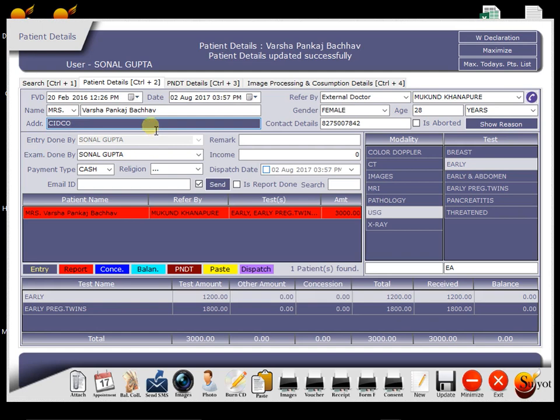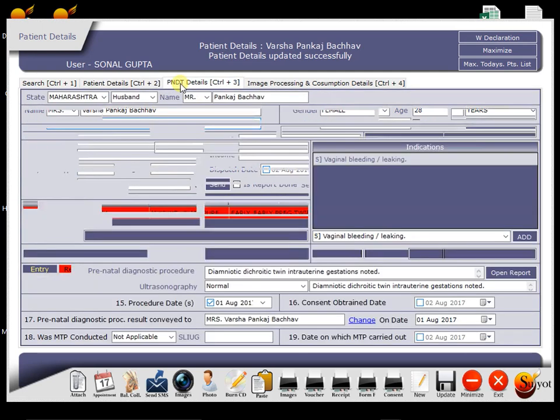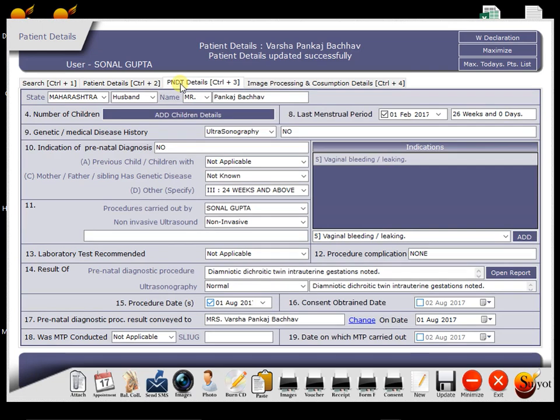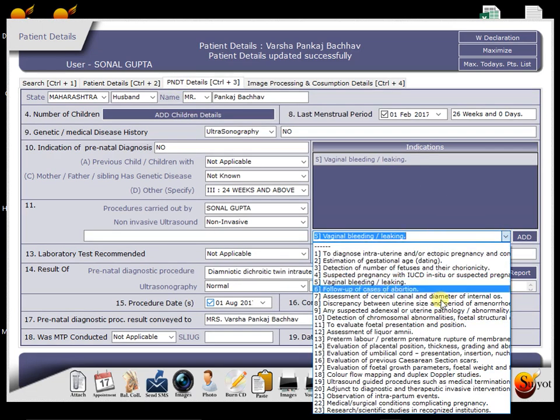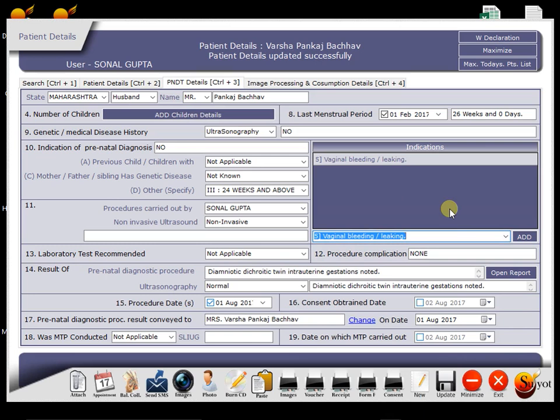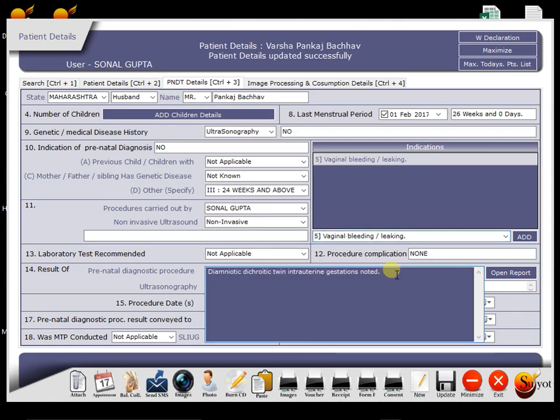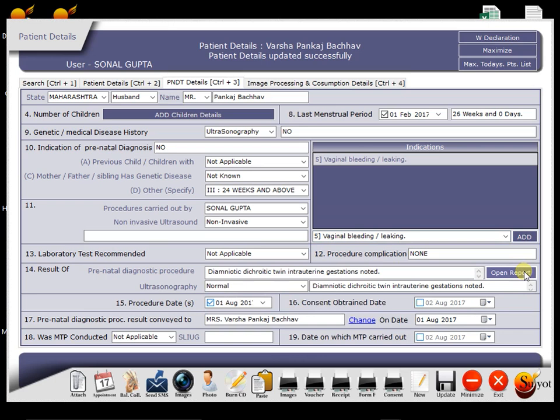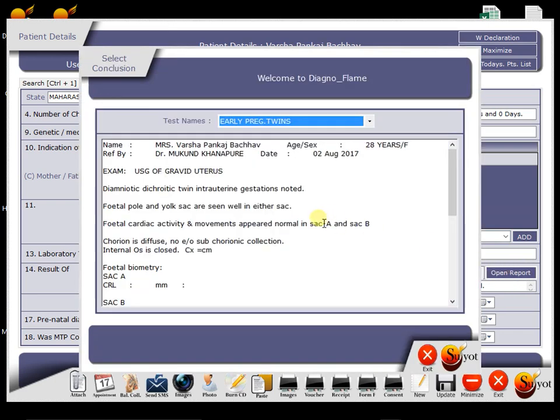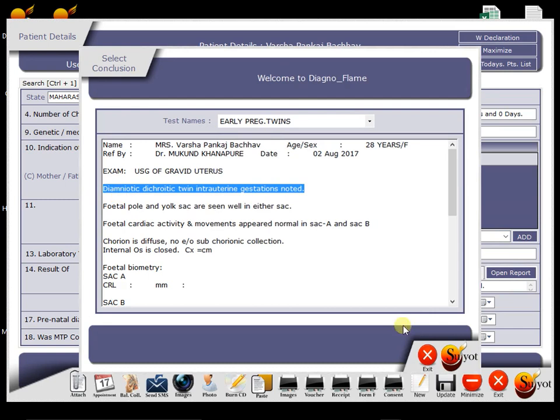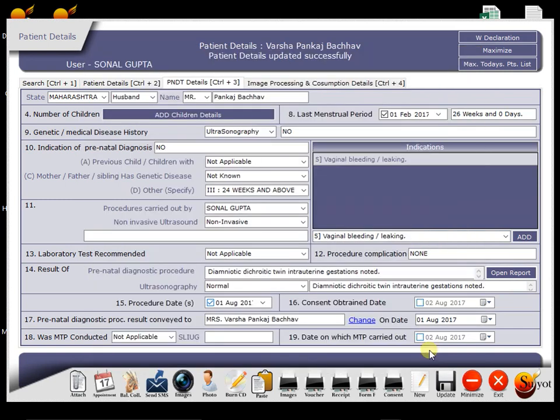So what is the use of the software here? Just go to the PCPNDT details tab, and we have to select only indications. All other information will automatically get carried forward to the website and remaining info, which is almost same for every patient, has been set by default. And then for impression, you have to just press open report and select impression. So impression also comes here automatically.